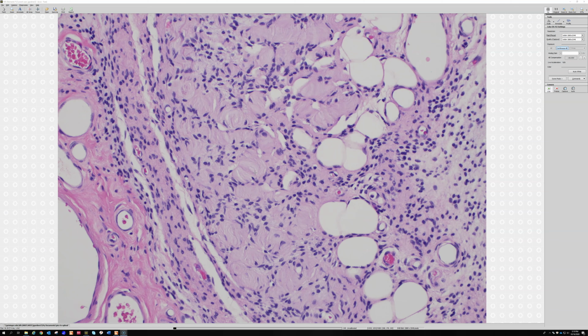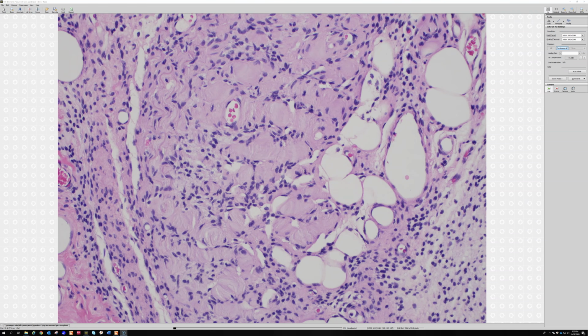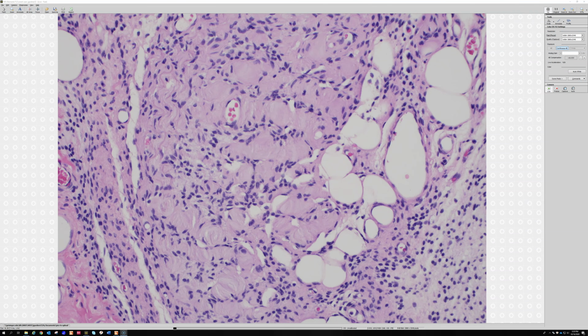I used to think they looked like kind of striped pink Easter eggs. And one of my histology colleagues at a former job that I had said that they reminded them of cotton candy. And I thought, oh, that's nice because it's loose and fluffy and swirly. So imagine 50 cotton candies stuck together here. So these are Wagner-Meissner bodies.